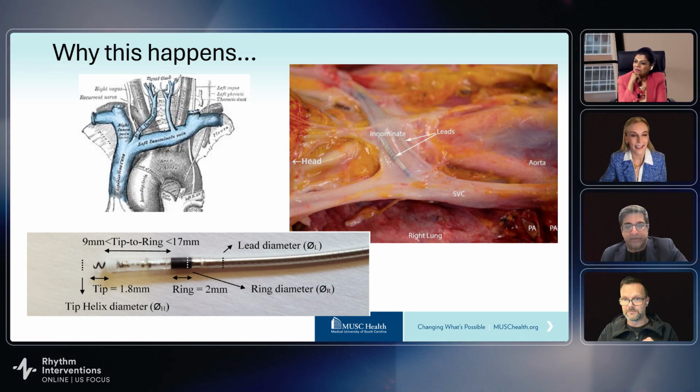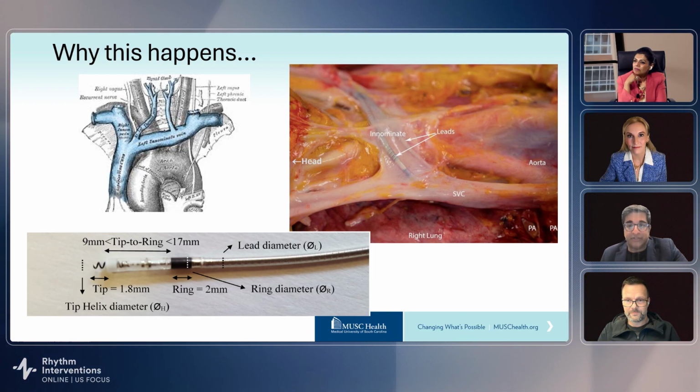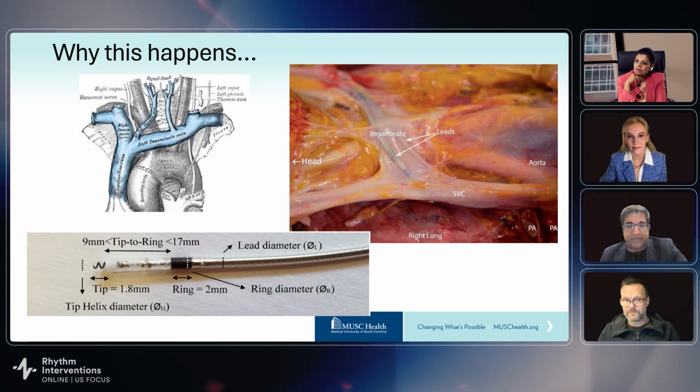I think there are also some factors in terms of the age of the lead. And we actually use implant age, so the age of the patient at the time they were implanted. That actually seems to be a factor that plays a role in this as well.